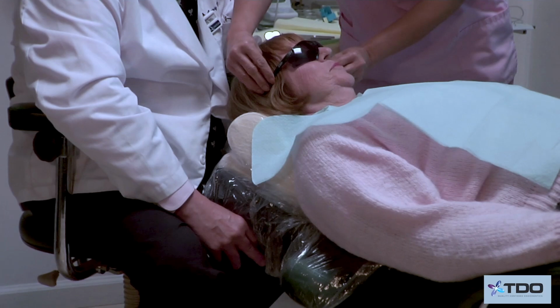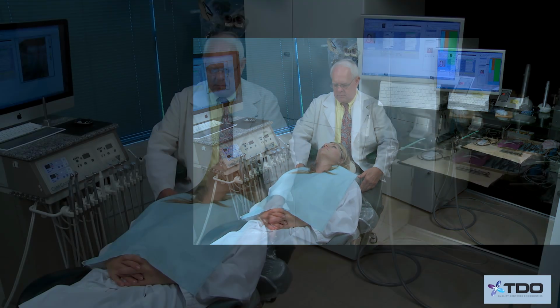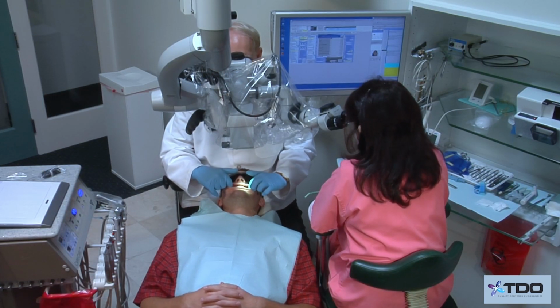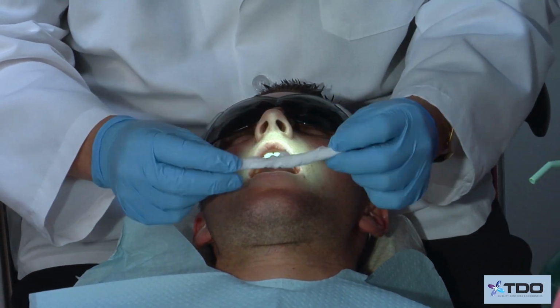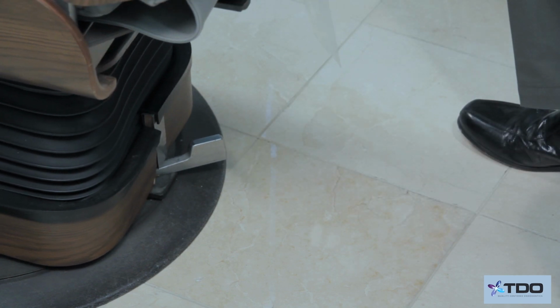This is because one of the secrets of efficient microscope use is to move the patient, not the microscope. Therefore, having a chair that floats is critical. The chair, and hence the patient's head, are moved by action of the clinician's knees and legs, as shown here. When choosing a chair, make sure the chair is easily unlocked and floats, as shown here.